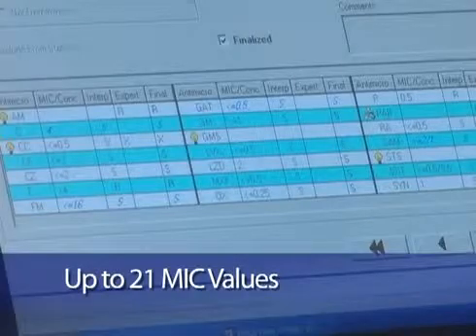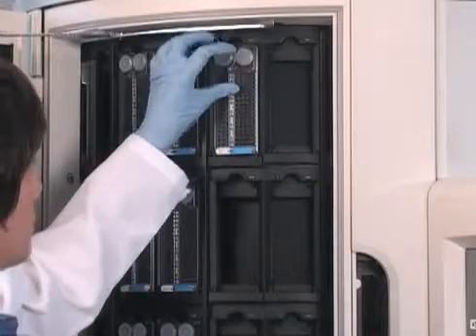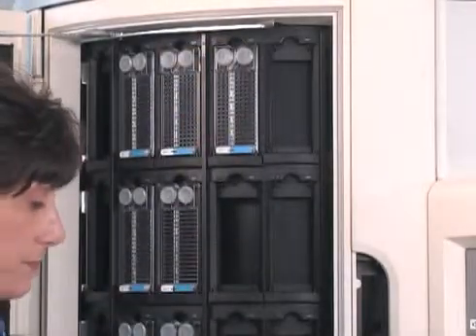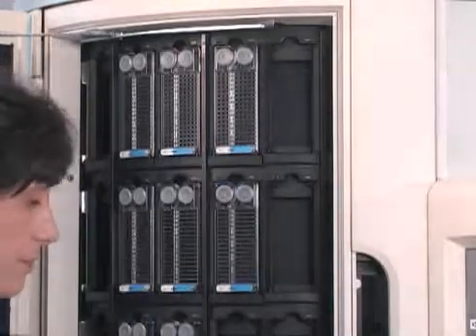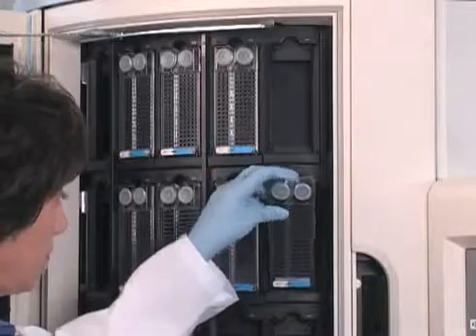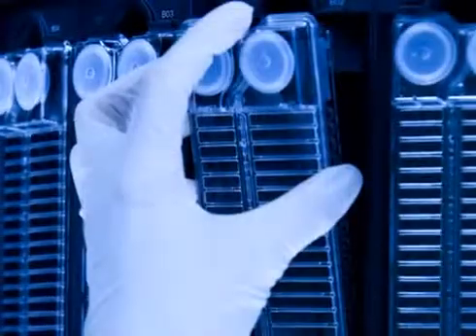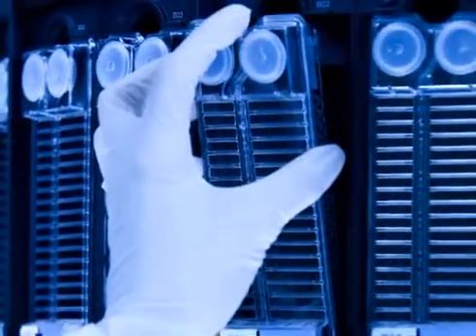The state-of-the-art BD Phoenix instrumentation uses no circulating fluids or complex moving mechanisms. The only moving part is the central carousel which houses the panels. Panels are only manipulated during the incubation loading cycle.